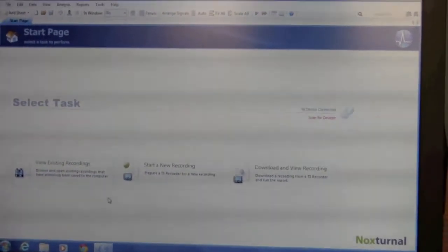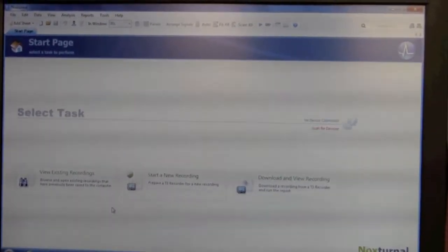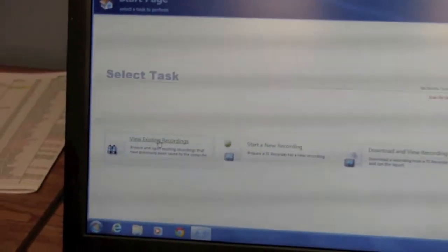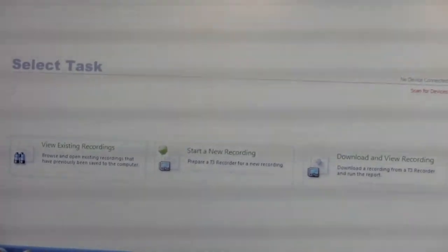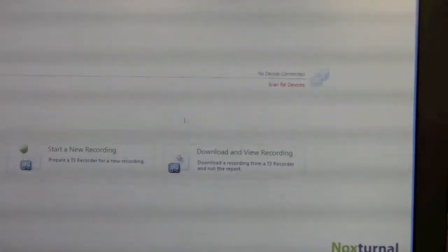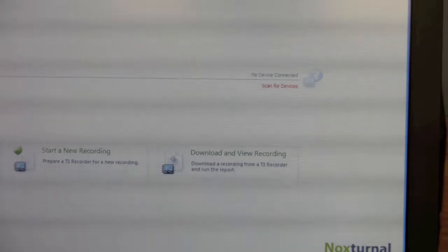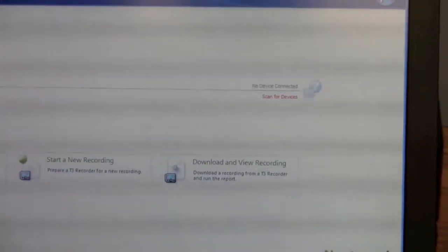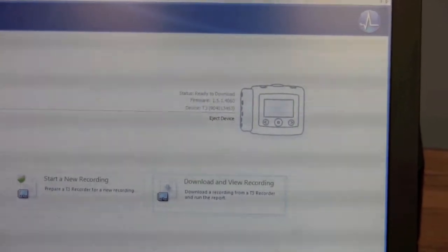This is the initial page of the Noxturnal software that comes with your Nox T3 monitor. At this screen you have a few options: once you have some recordings you can review them, you can start a new recording — which is what we're focusing on today — and when your patient returns the monitor, this is where you would download and view your recording. To start, we're going to plug in the USB cable connected to your monitor. Watch the upper right-hand corner — you will see your monitor connected.